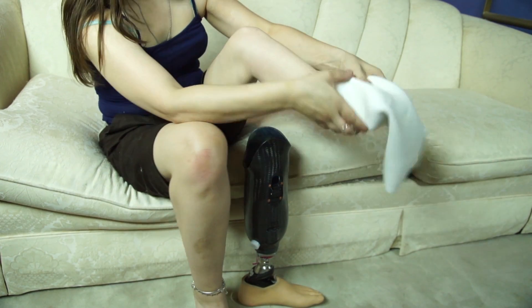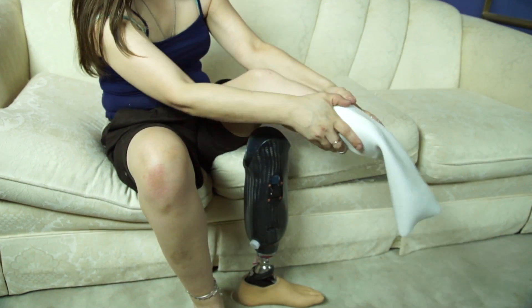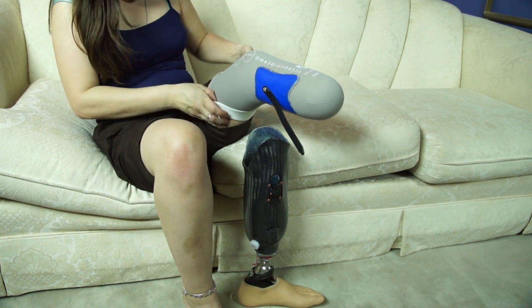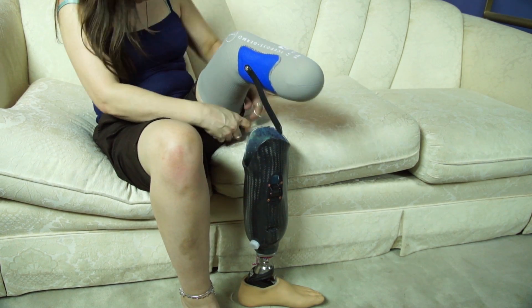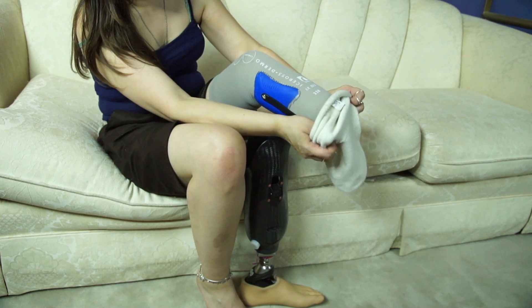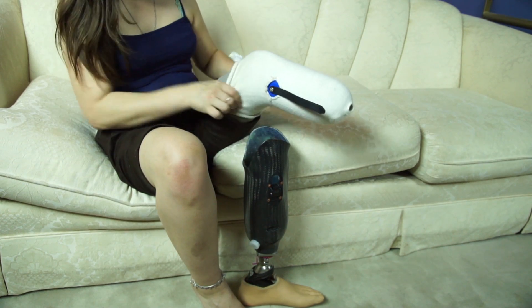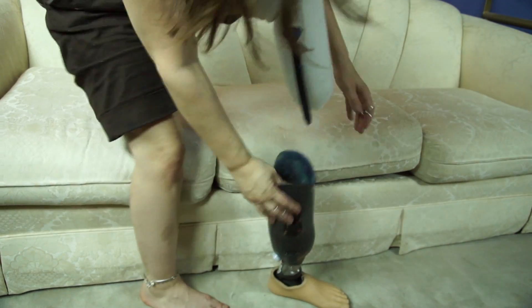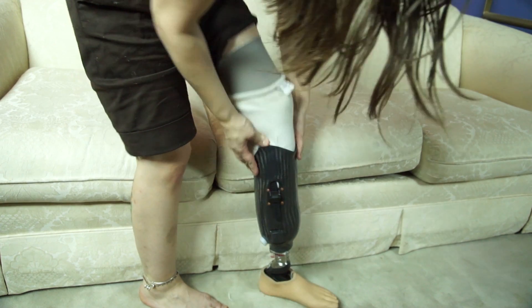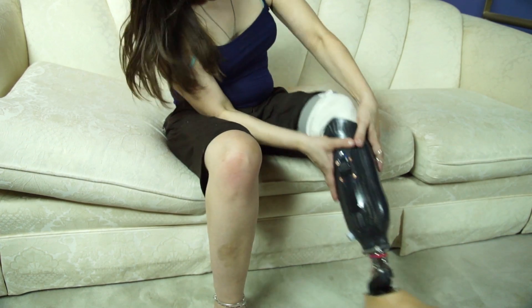To put a prosthetic leg on with the Coyote Proximal Lock, you have to make sure the lock is in the right position, which you sort of learn by feel. Then you add the appropriate number of socks to fill out the extra volume, because your leg changes volume throughout the day. Then you step down into your socket, and it makes a cool ratchet sound. And now my leg is secure in place and won't come off.